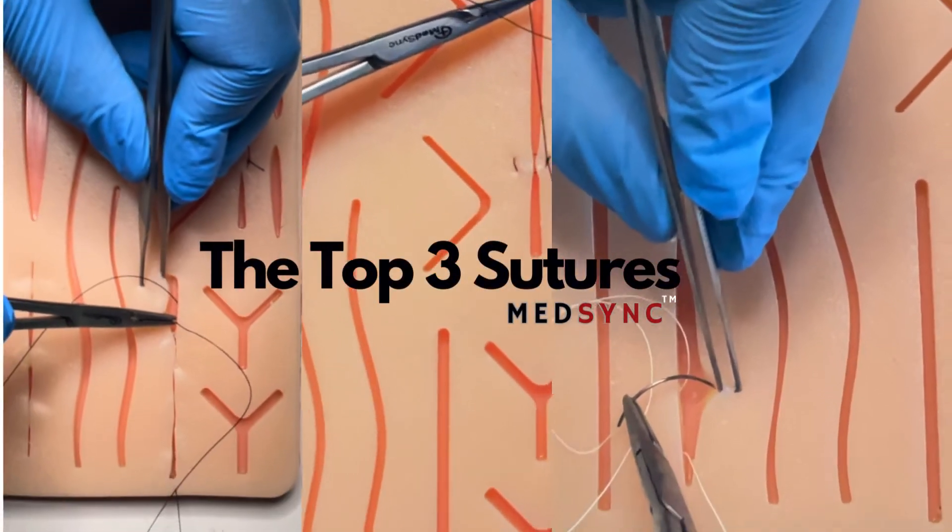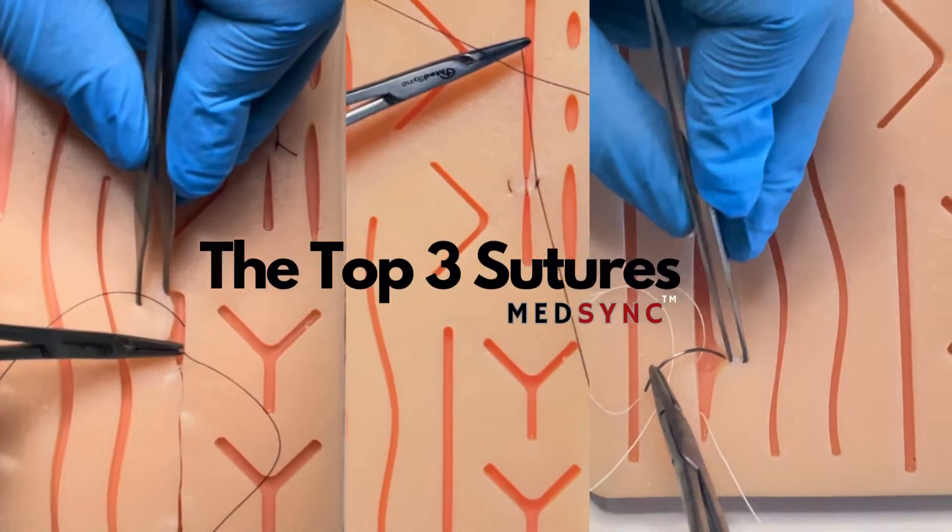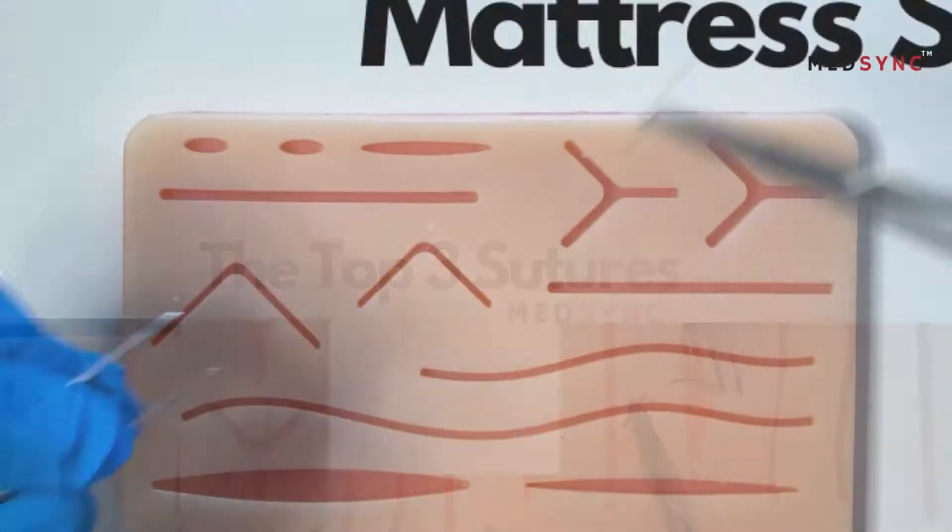In this video we are showing you how to perform our top three most useful techniques for wound closure.